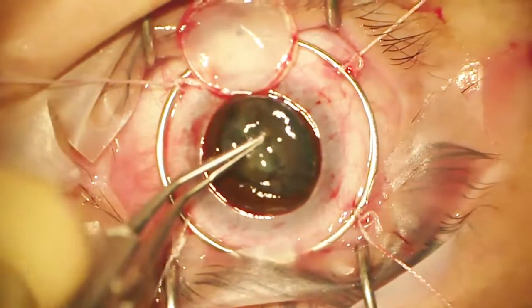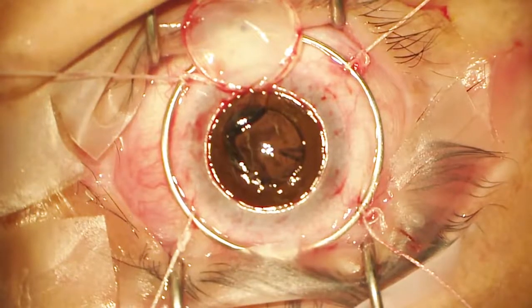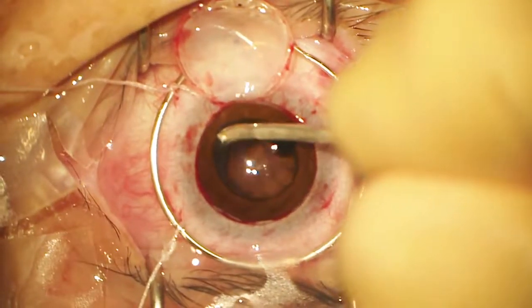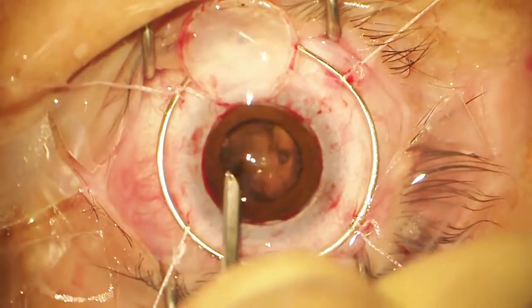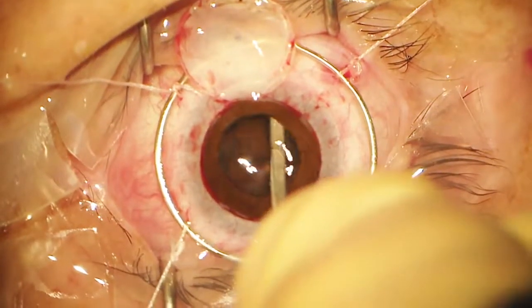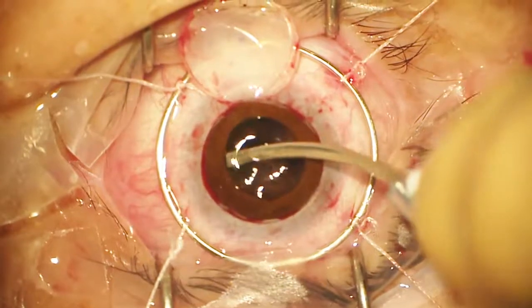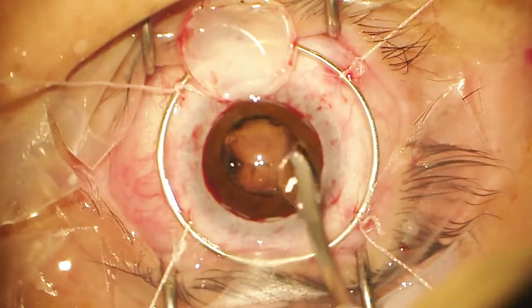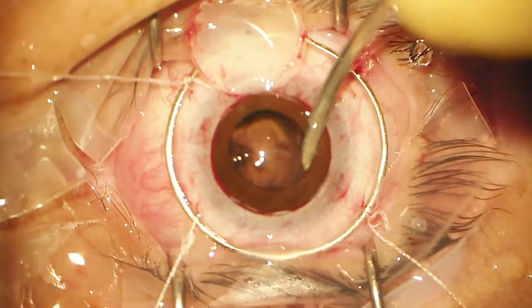Give me the lens flip, please. There's our lens. Lights down. Simcoe needle, please. Now to remove the cortex, we're going to use a Simcoe needle, which is a very simple irrigation aspiration device. Let's have fluid, please. Since we're doing this open sky, of course, you have a very flattened capsule, so you have to be extremely cautious not to pick up a capsular remnant and rip the capsule. There's always more cortex than you think there is.